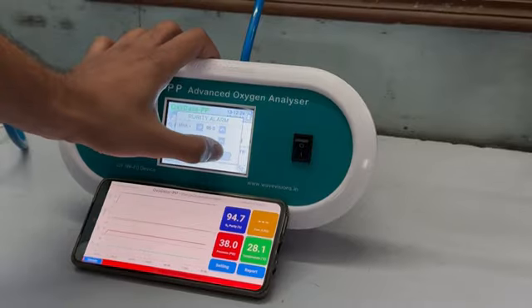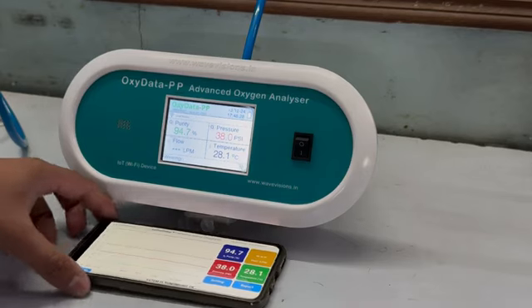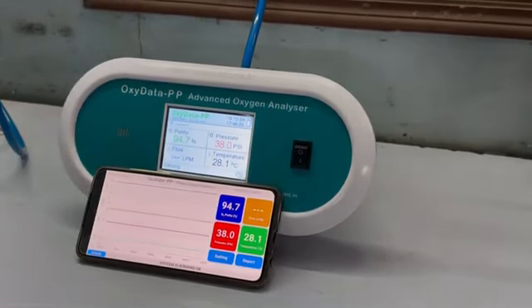And click on the OK button, and see the error is gone. And this was the thing for the home screen.